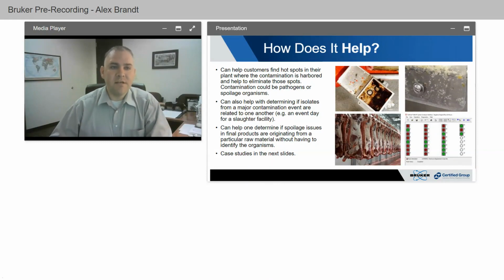I've got some case studies in the next few slides where we'll dig into each of these different situations a little deeper and give you some real life perspectives on how we use the technology, the Bruker IR Biotyper, to accomplish some of the challenges, if you will, that we were presented with in each one of these case studies.